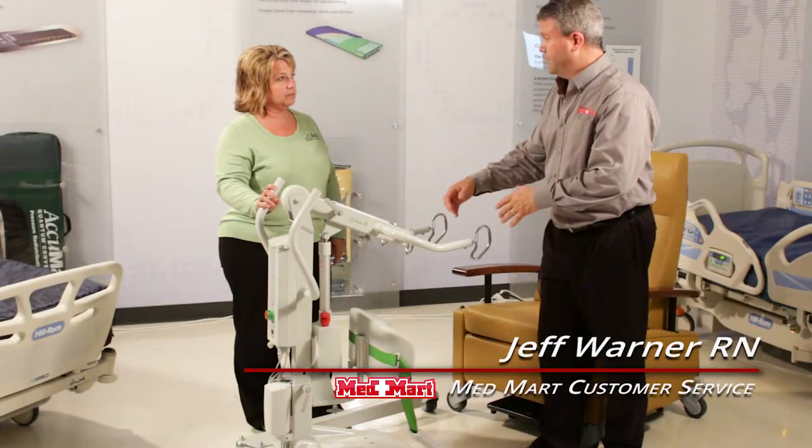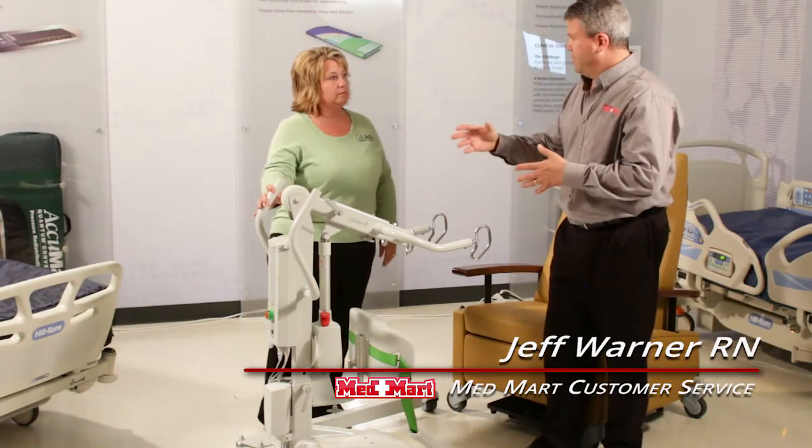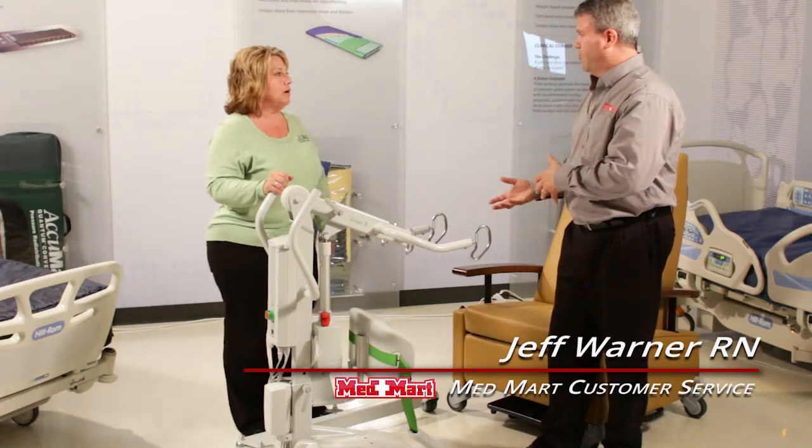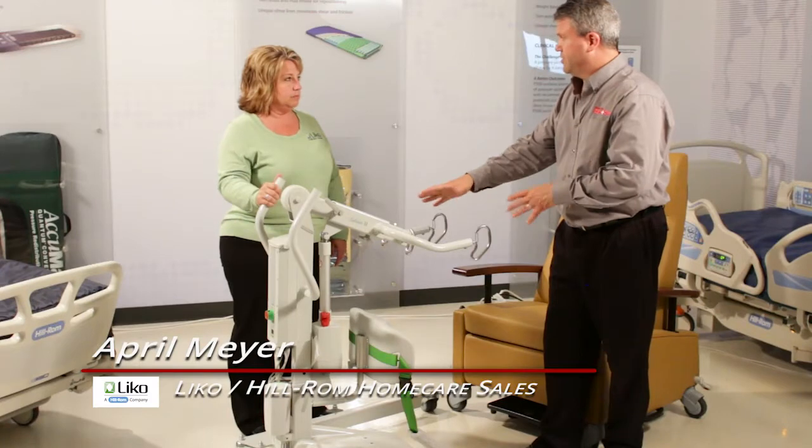One of the advantages we like about the Sabina tube is the fact that you can use it as a sit to stand, like we've talked about. But now we can no longer support ourselves, so we can turn this into a sit to sit — it just takes a little conversion. We're going to show you how to do that.